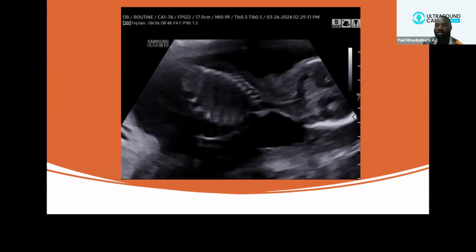All right, thank you very much. Okay, so to Lasha Jones, the question that was asked is: is the presence of a fetal echogenic kidney a predictor of possible polycystic kidney or MCKD? I think it's also for Dr. Koskun. Yes, it is about the kidney. It's a good question also. If the kidneys are echogenic, in normal conditions in the first trimester the normal kidneys are also echogenic.